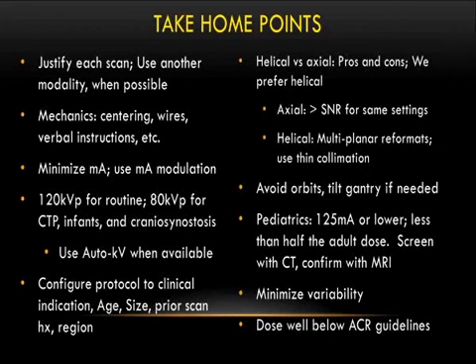Pediatrics, you can really lower the dose, minimize variability, and you can actually nowadays perform at a dose level way below the ACR guidelines. You can probably do a scan somewhere between 1 millisievert to 2 millisievert effective estimated dose. Okay. I think with that I will stop, and I'll take any questions.